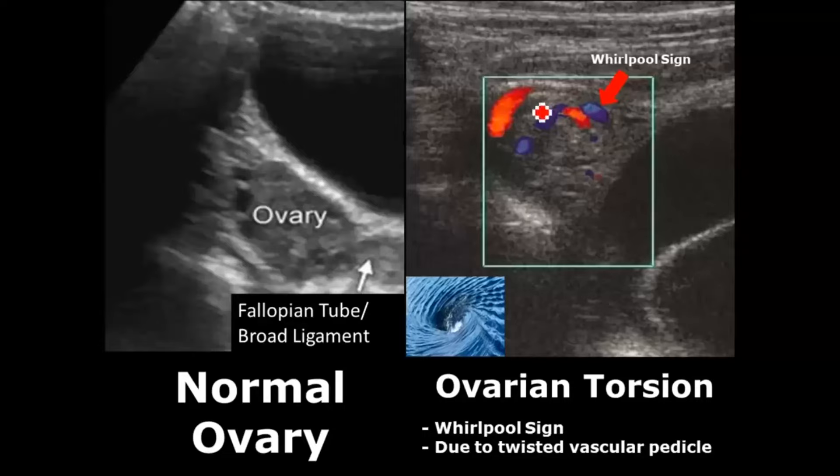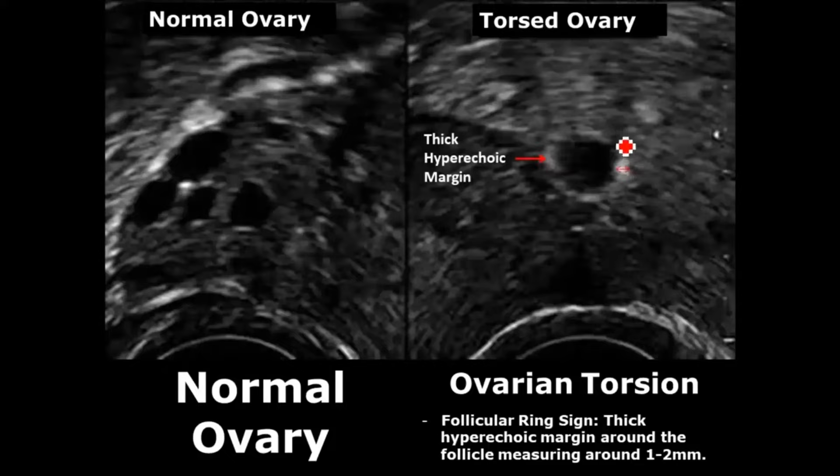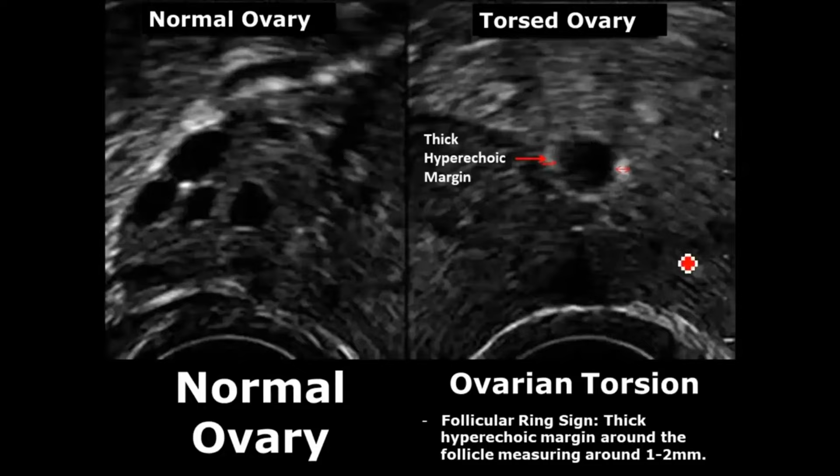Another important sign in some cases of ovarian torsion is the follicular ring sign — a thick hyperechoic margin around the follicles that can measure 1 to 2 millimeters.